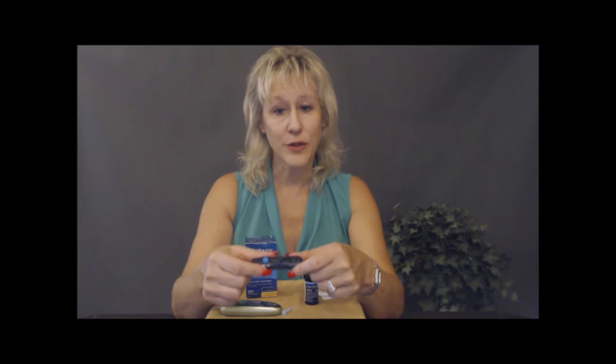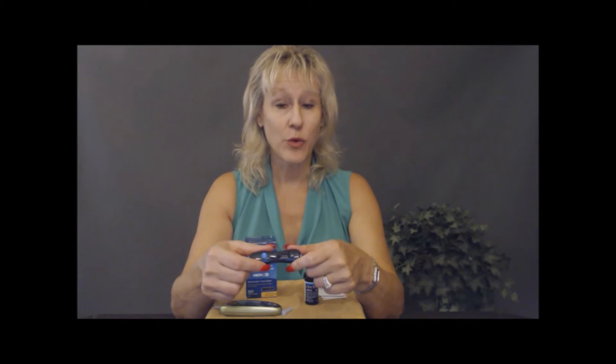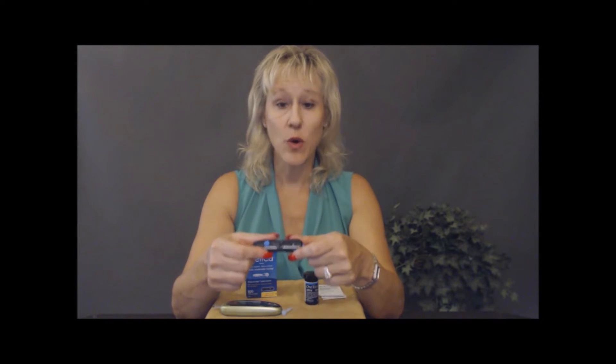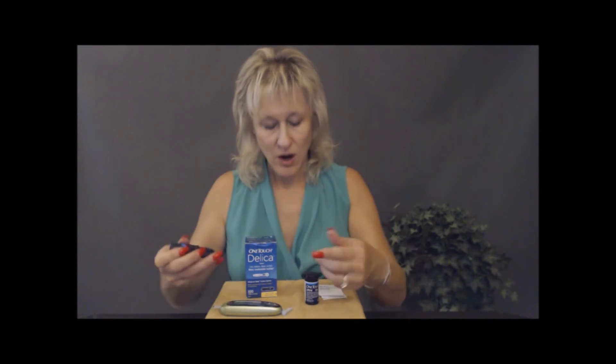Different lancets are all a little different. For myself and my female clients, three seems to work well. For male clients, your skin is a little thicker and you may have more calloused hands, so you may want to go up to a four or possibly a five. But you should never feel great pain when you're doing this — if you are, just check the length of the needle that's poking you.